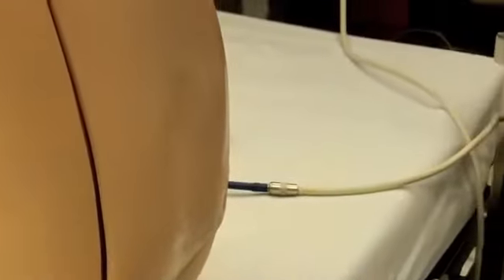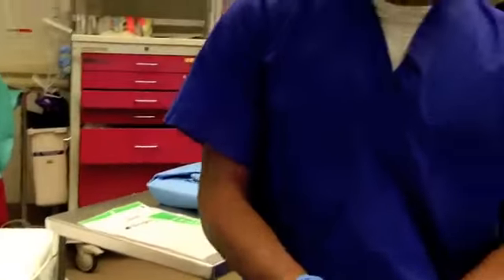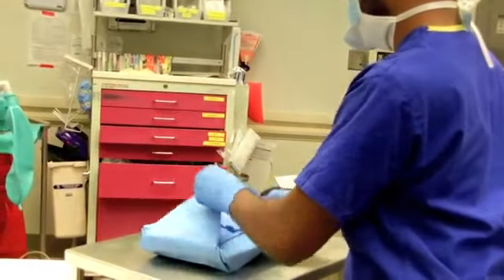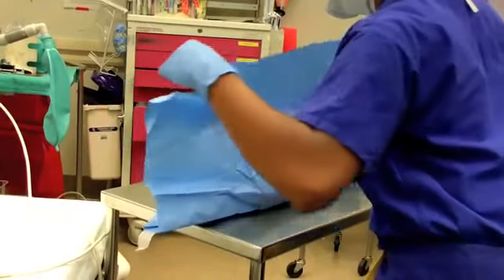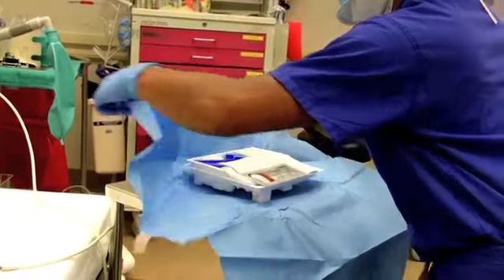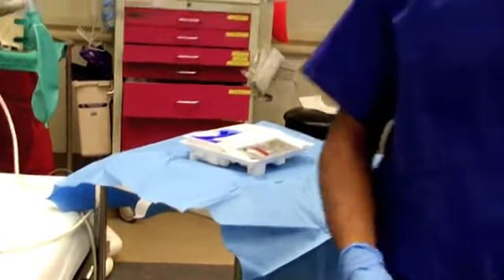Step 5. Open the spinal tray before placing sterile gloves on. I will now open the spinal tray. Step 6.